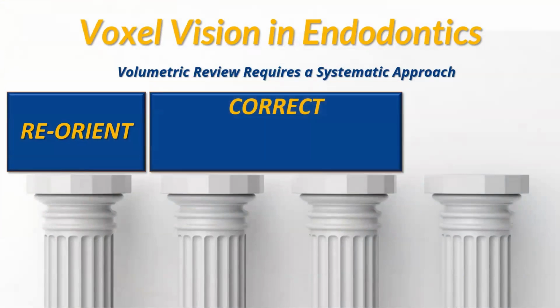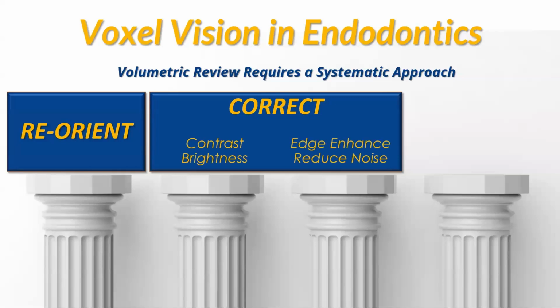The second comprises two components: we need to correct the data. It is rare that cone beam in and of itself, when we press the button and visualize the image without correction, has the adequate density as related to contrast and brightness, or the adequate image fidelity as regards edge enhancement and reduced noise that we need. So we usually do need to correct this. Some machines are capable of using preferences to adjust this for particular types, and we use that quite extensively here.